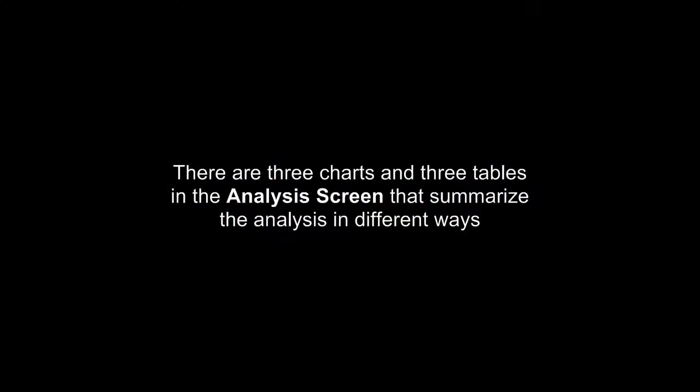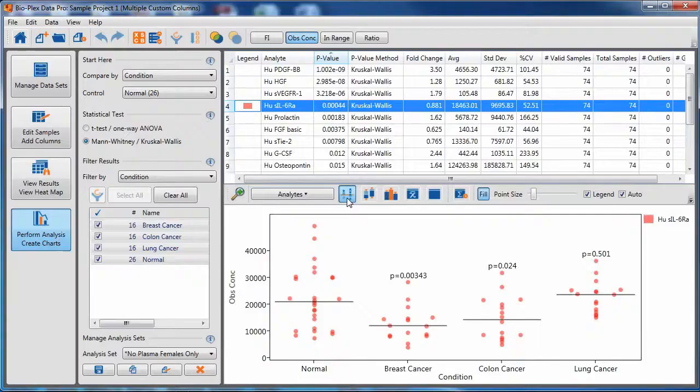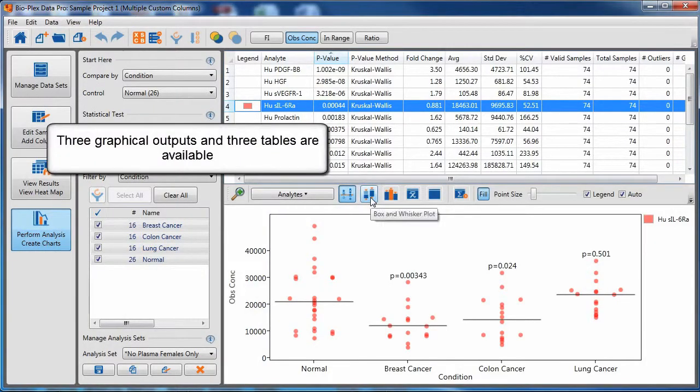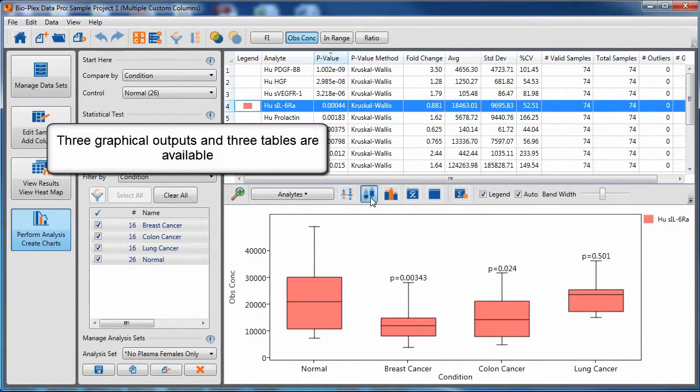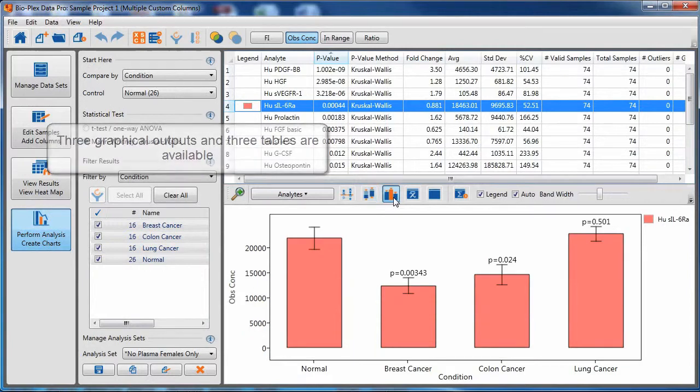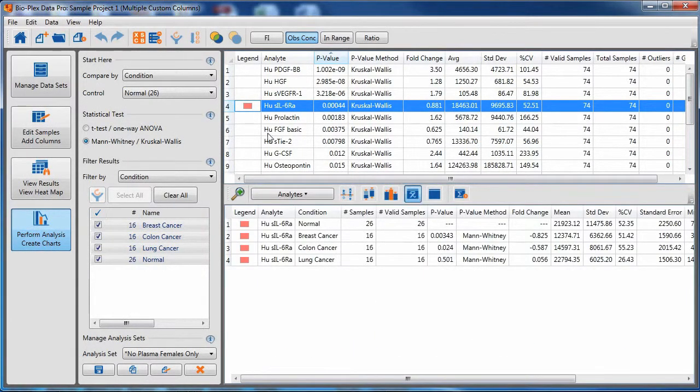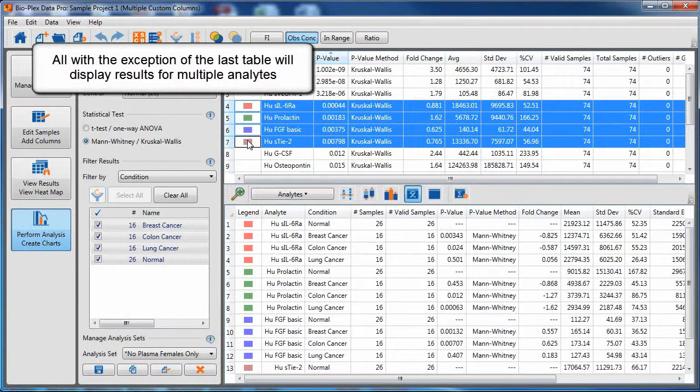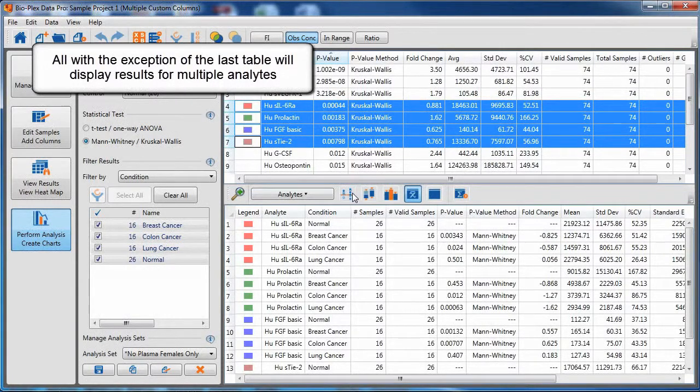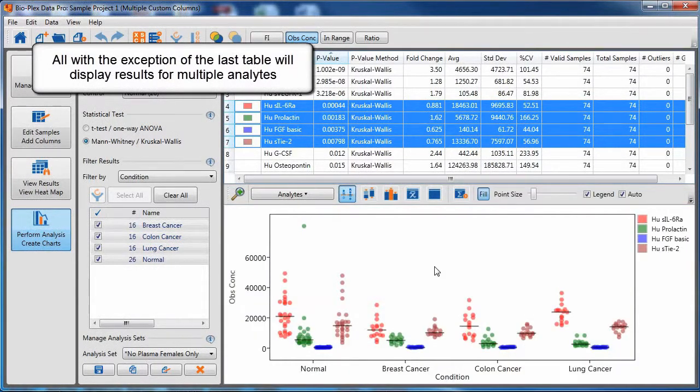There are three charts and three tables in the analysis screen which summarize the analysis in different ways. All with the exception of the last table will display results for multiple analytes.